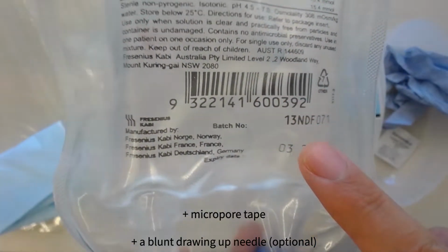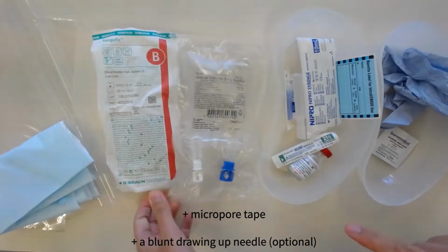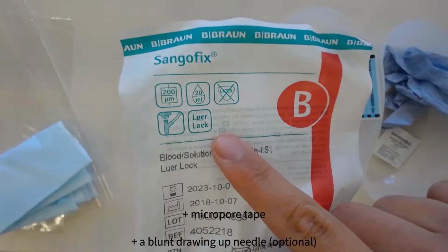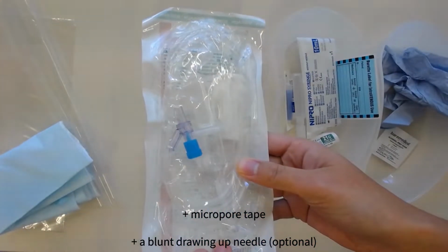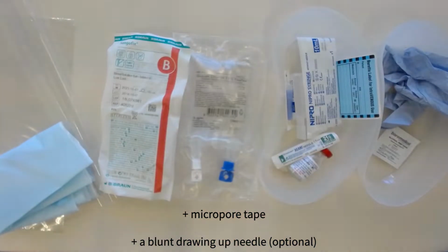So you're also checking the bag for color, clarity, and integrity. Here's my giving set. It's a macro set as indicated by the 20 drops per milliliter symbol, and the hourglass has the indication of the expiry date. Plastic bag, a bluey, and some micropore tape if you don't already have it.